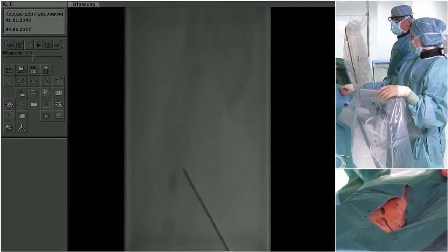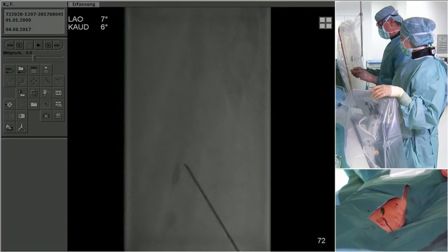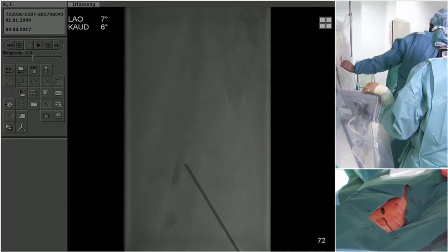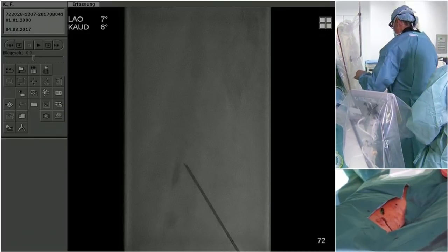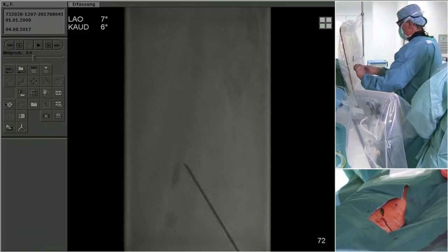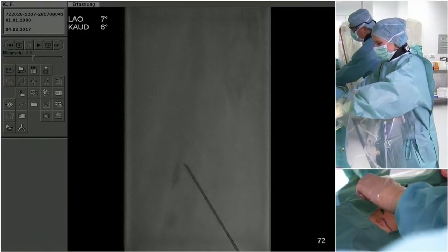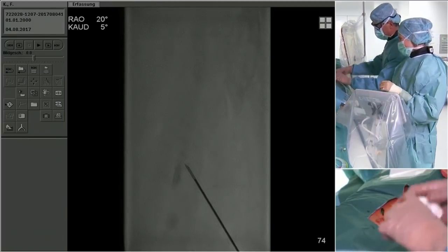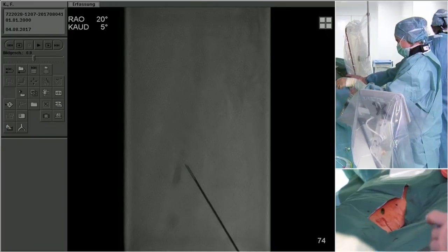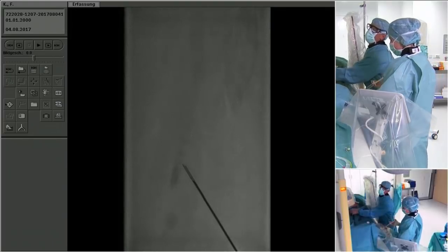Why not now? Posterior. You mean the posterior tibial? Yes. I think looks like he's in. I expect that I need a re-entry device from retrograde, and therefore that will be 6 French. And therefore, clearly, I will not take the posterior tibial artery. For the proper needle, I only need 4 French, but very helpful would be to have a very direct access to the occlusion, to the culprit lesion, and from the posterior artery up, that way is too long.